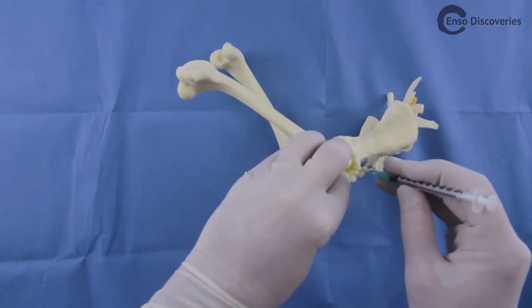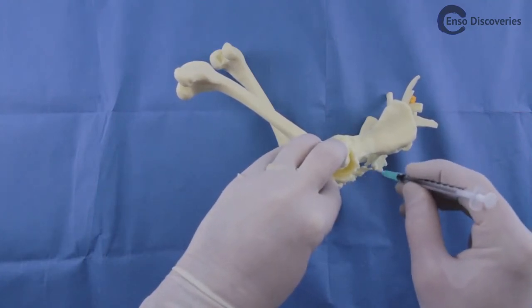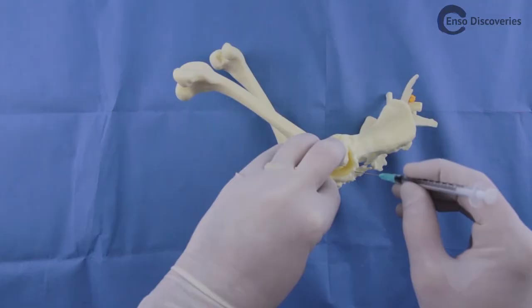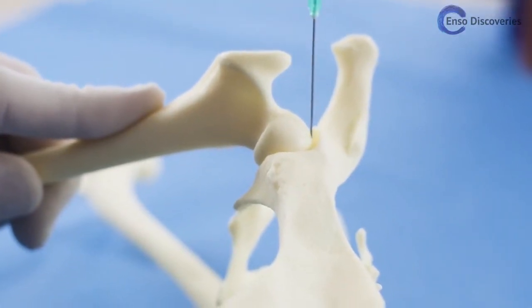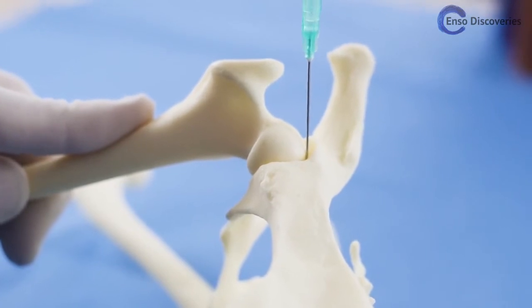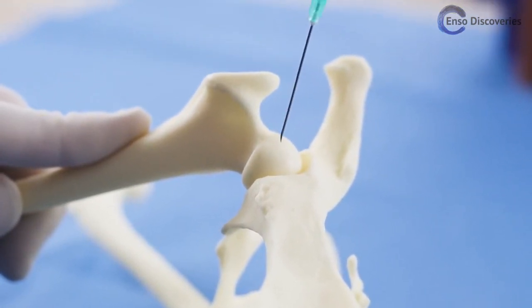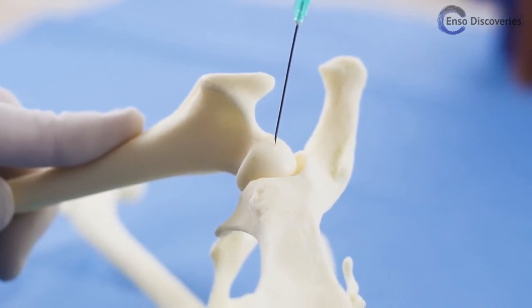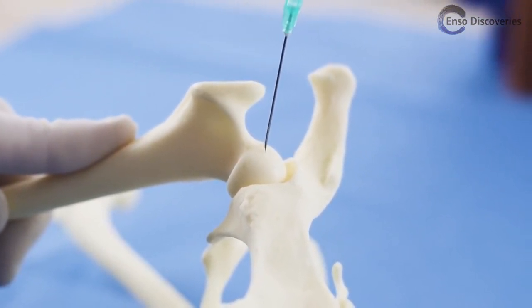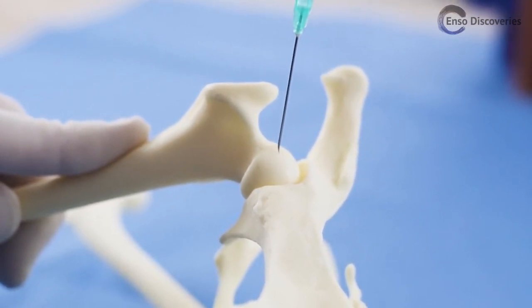Advance the needle until you feel yourself pop into the joint or you hit something solid. If you feel the needle fall into the joint, go ahead and inject. If not, you'll need to walk the needle into the joint space. Always walk the needle in the same plane as the greater trochanter. If you were to walk cranial or caudal but the tip were on the pelvis dorsal to the acetabulum, you would never cross the joint space.